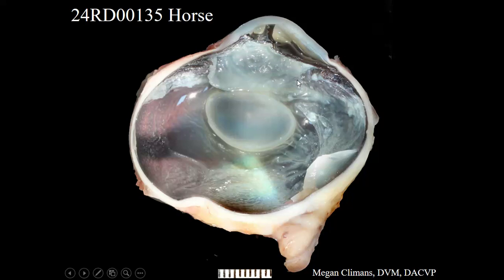And then the probably posterior iris, but certainly ciliary body surface especially, is coated with this kind of white film. And you can see maybe strands of this also extending into the vitreal space and things like that. So this interesting film is important. And then we have a cloudy lens. And then we also have this subretinal bubble of sorts.